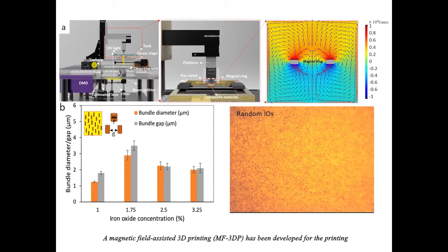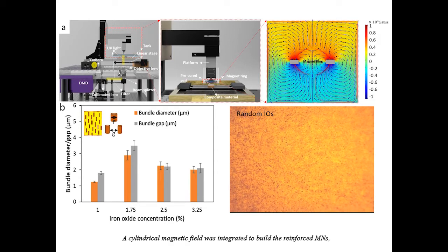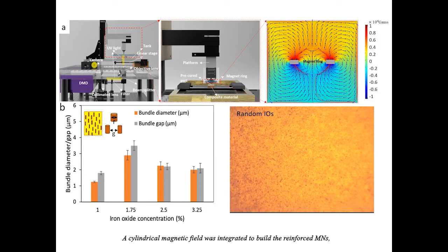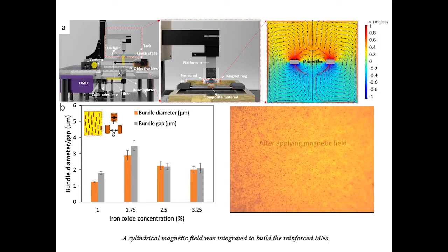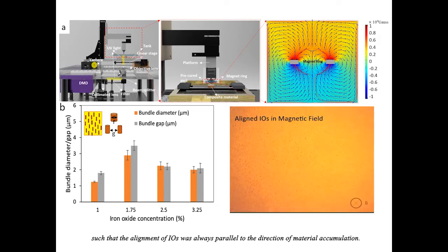A magnetic field assisted 3D printing, MF3DP, has been developed for the printing of bio-inspired microneedle arrays. A cylindrical magnetic field was integrated to build the reinforced microneedles, such that the alignment of IOs was always parallel to the direction of material accumulation.